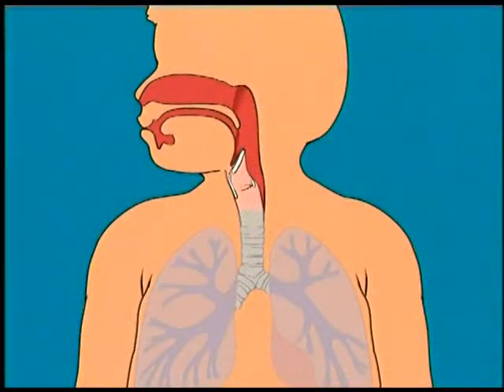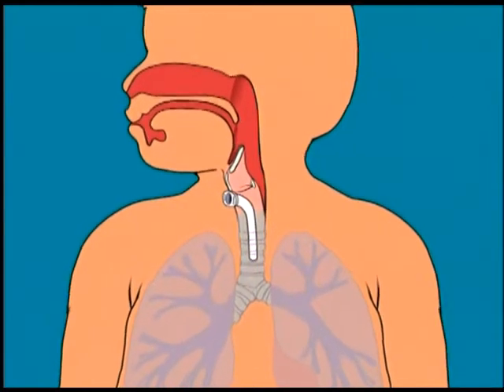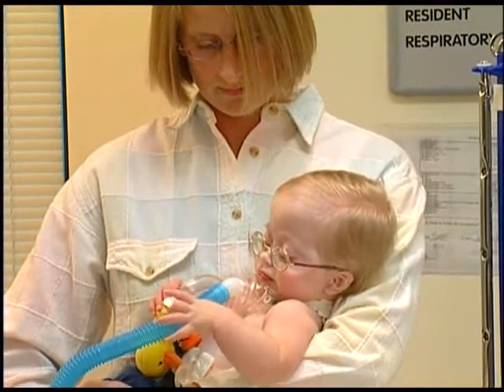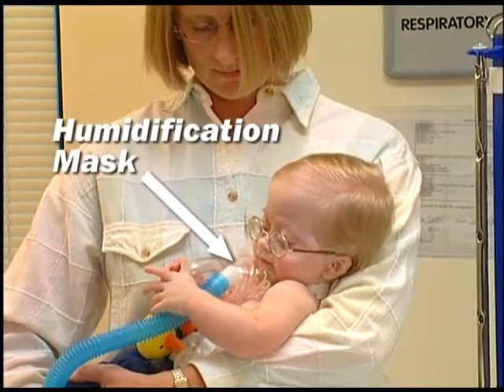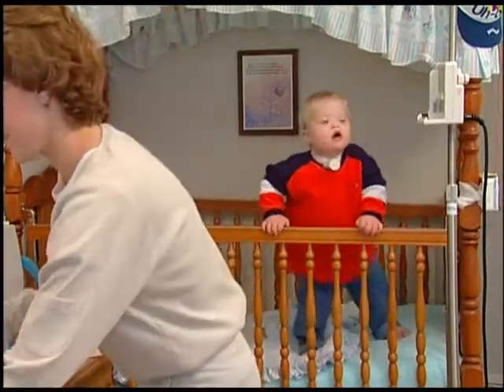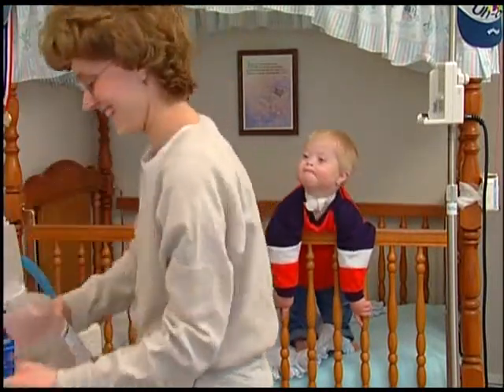Normally, when air is breathed in through the nose, it is filtered, warmed, and moistened. A child with a tracheostomy does not breathe through his nose, and therefore the air breathed through the tracheostomy is dry air. This tends to dry and thicken the secretions, making it difficult to remove with suctioning. This can lead to the mucus plugging up the tracheostomy tube, which can be very dangerous. Some options to increase humidification are humidified air delivered by a trach mask or the use of an artificial nose. Your healthcare team will arrange for a proper source of humidification for your child's tracheostomy and will instruct you on proper use.